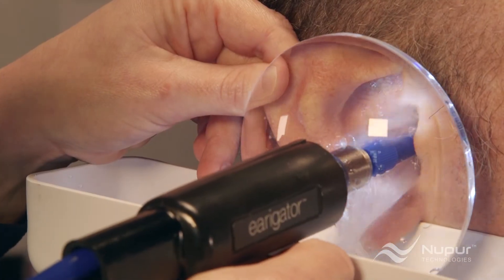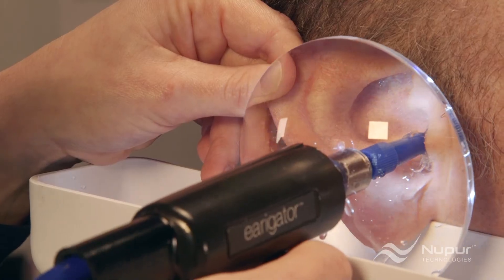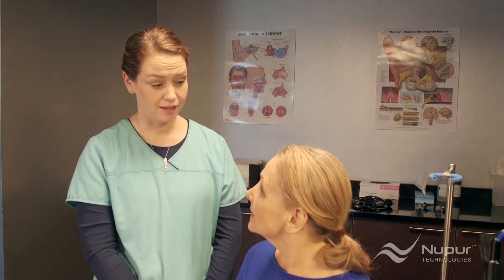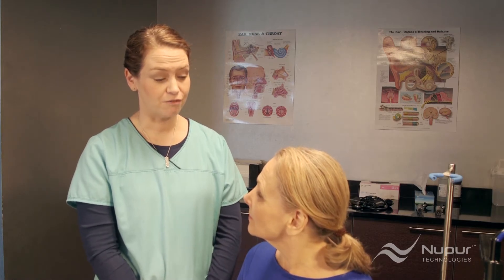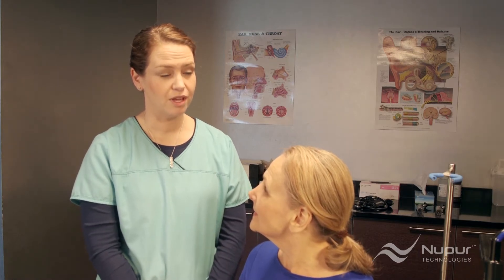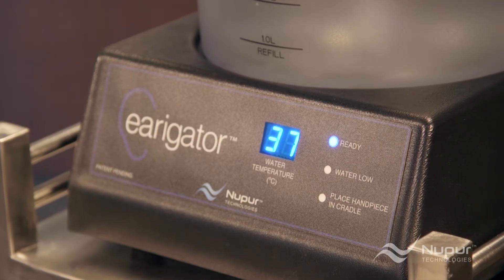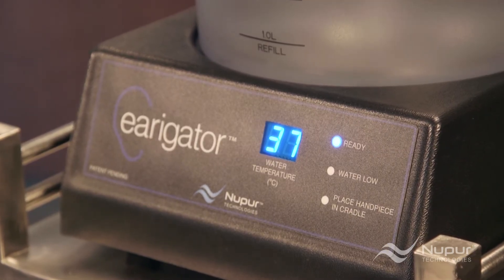This allows proper placement of the handpiece lens while irrigating, providing an optimal view of the ear canal, and prevents most water splash from getting out of the patient. At this point, Rachel explains to the patient that she will feel a full sensation of water in the ear and turbulence. Some patients might feel a little discomfort — explaining this may help make the patient more receptive to the treatment. The irrigator light glows, signaling ready to use. The temperature display will show 37 degrees Celsius, or body temperature, plus or minus 2 degrees.